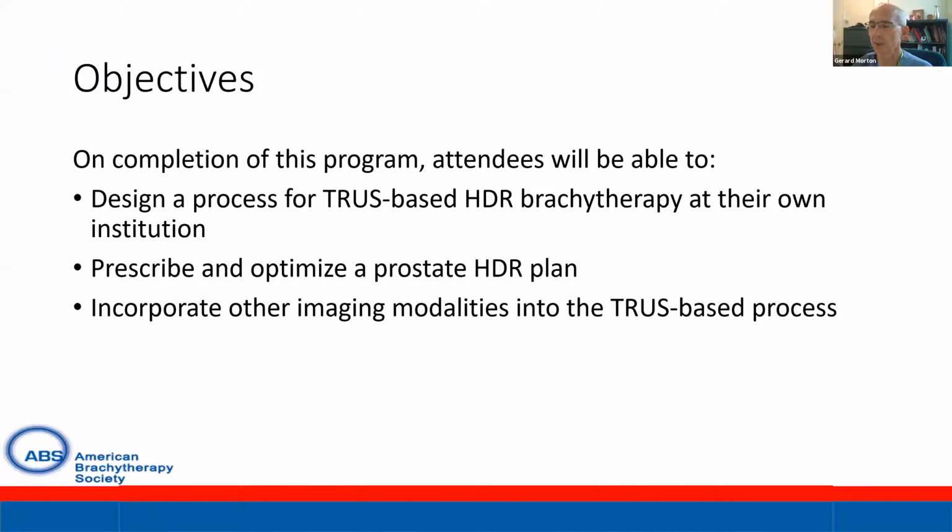The objectives of the next hour or so will be to enable the attendees to design a process for TRUS-based HDR brachytherapy at their own institutions, know how to prescribe and optimize a prostate HDR plan, and incorporate other imaging modalities, in particular MRI, into the TRUS-based process. So without further ado, I would like to invite Dr. Krauss to take over and share his screen.